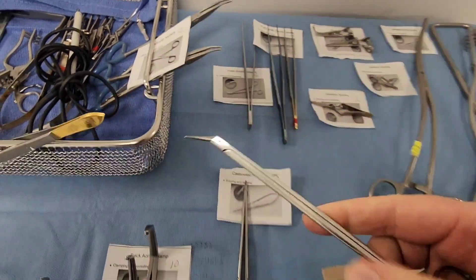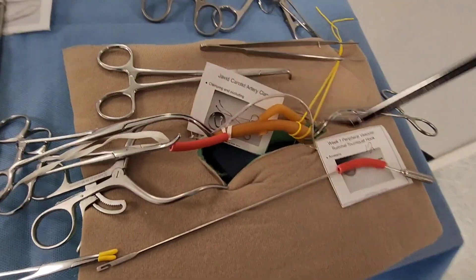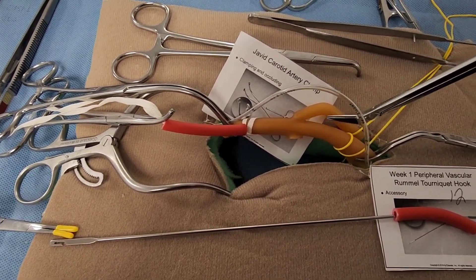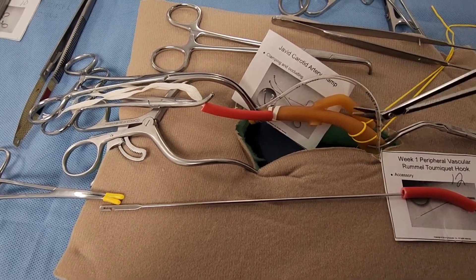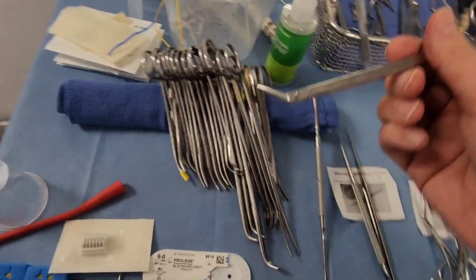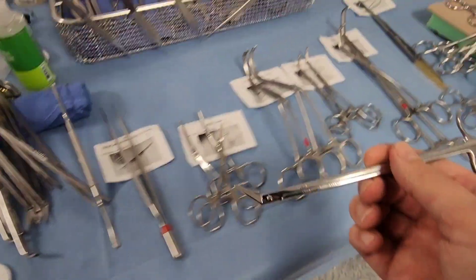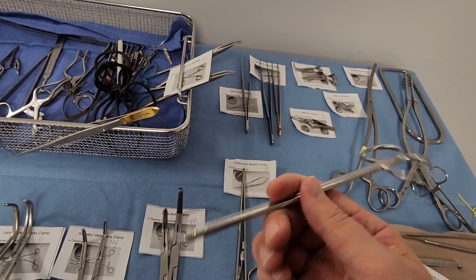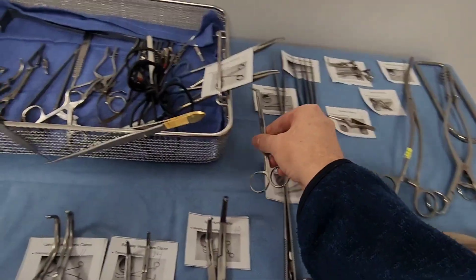Here are Potts scissors — notice the angle, which can be 50 or 60 degrees. In a carotid endarterectomy, you do an arteriotomy at the bifurcation with an 11 blade, then need to extend that incision. The Potts scissor is designed to come at a certain angle and extend that incision. They come in many shapes and sizes based on the degree needed to reach specific anatomy. They're designed to extend arteriotomies or incisions in arteries.